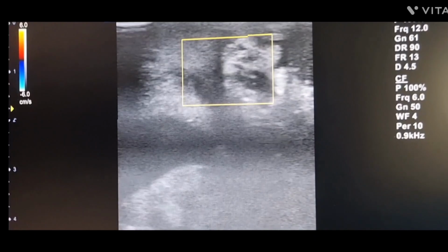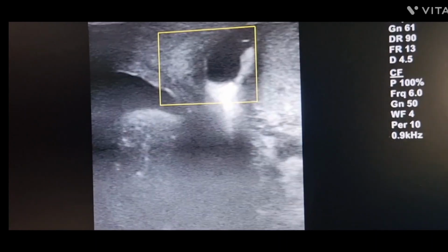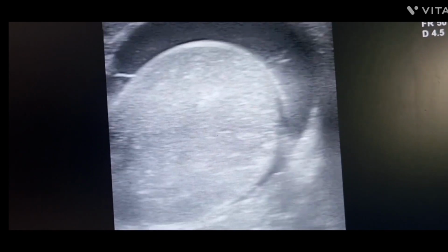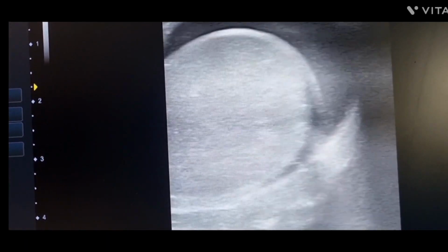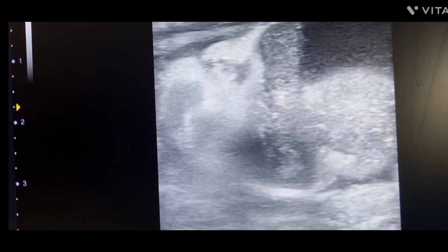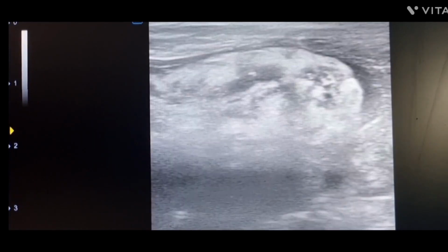Okay, so all the above findings suggest that this is a case of epididymitis and funiculitis, that is infection of the epididymis and spermatic cord. Due to this infection, inflammation occurs that causes pain, reactive hydrocele and scrotal wall edema. If proper action is not taken, it can also lead to orchitis, that is infection of the testis, and further worsen the condition with abscess formation.